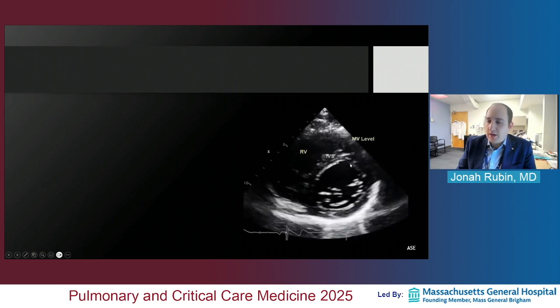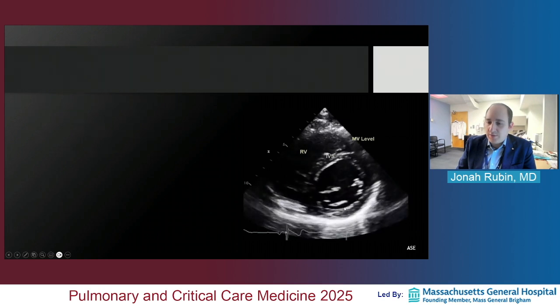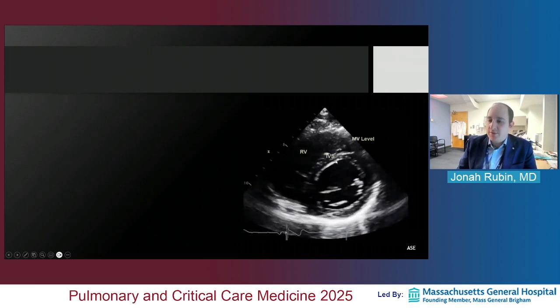We're at the base of the heart over here, and you can look for thickening across the ventricular muscle all throughout. You might get septal flattening at this level in severe RV dysfunction, where you get the D sign, which I'll have a case to show you.